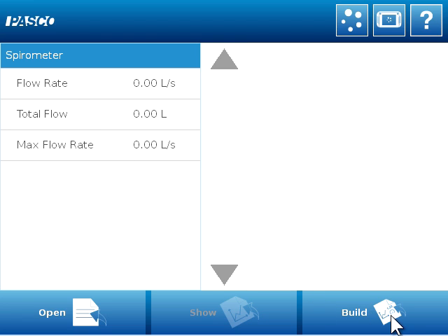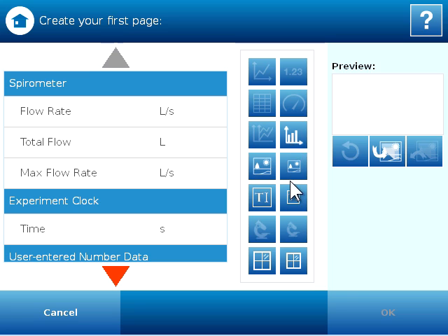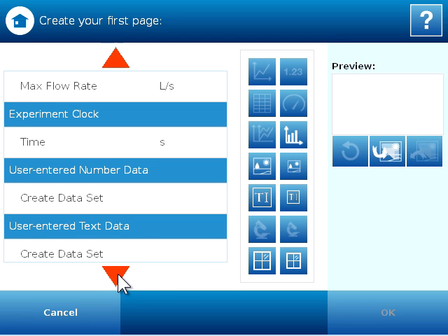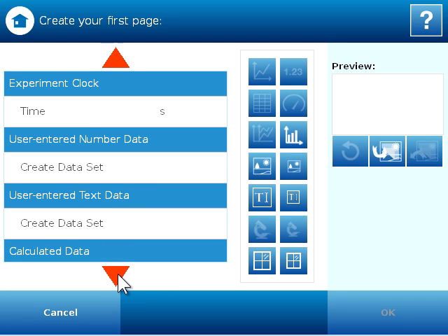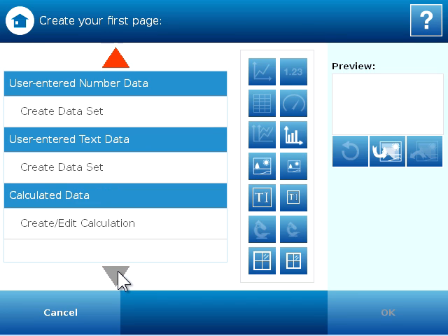So I'm going to select build, and here I could select a sensor measurement and a couple different ways to view that data, but what I'm looking for is the calculated data tool. So I scroll to the bottom and I've got calculated data and I'm going to create a calculation.